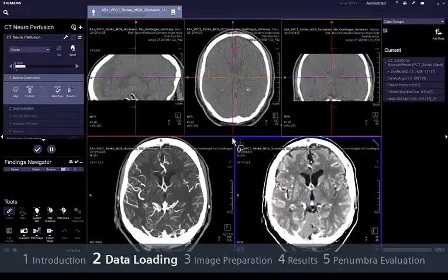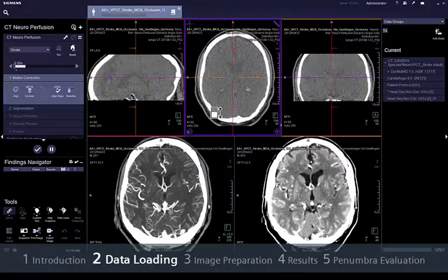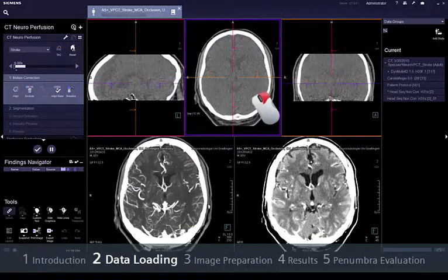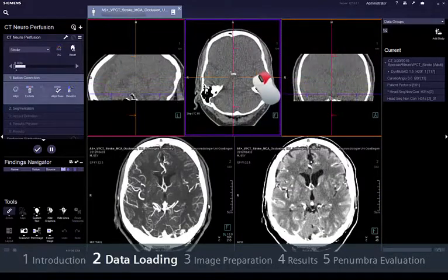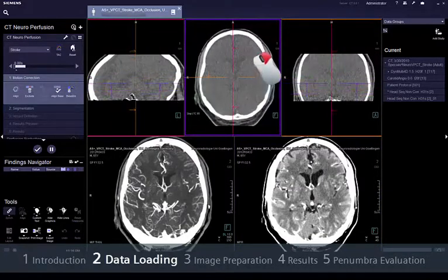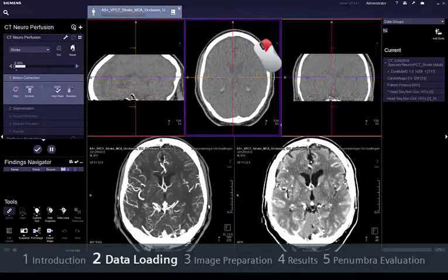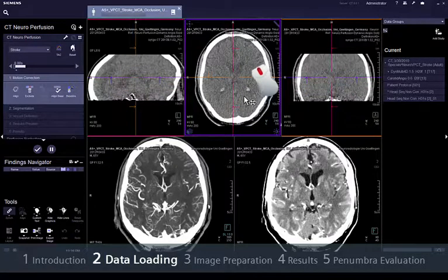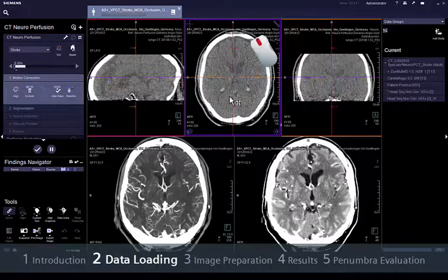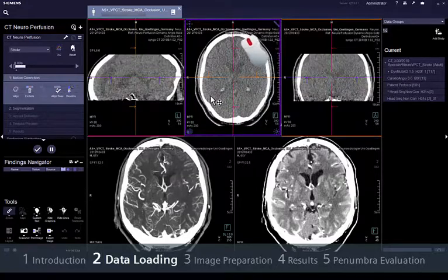Navigation can be done in any of these segments by pressing the right mouse button and dragging the mouse vertically. Window corrections can be done by pressing the middle mouse button and dragging the mouse vertically and horizontally.